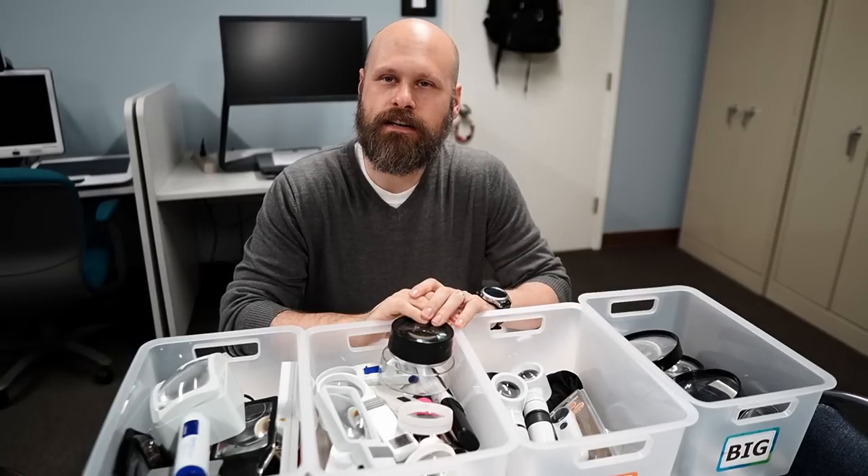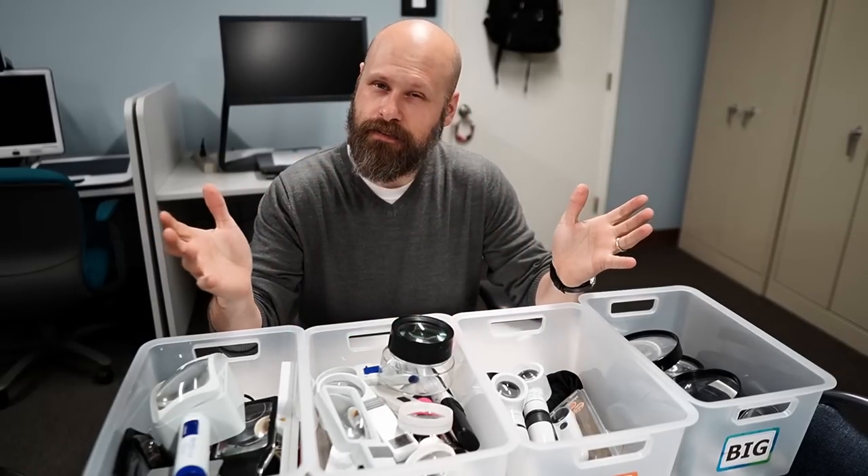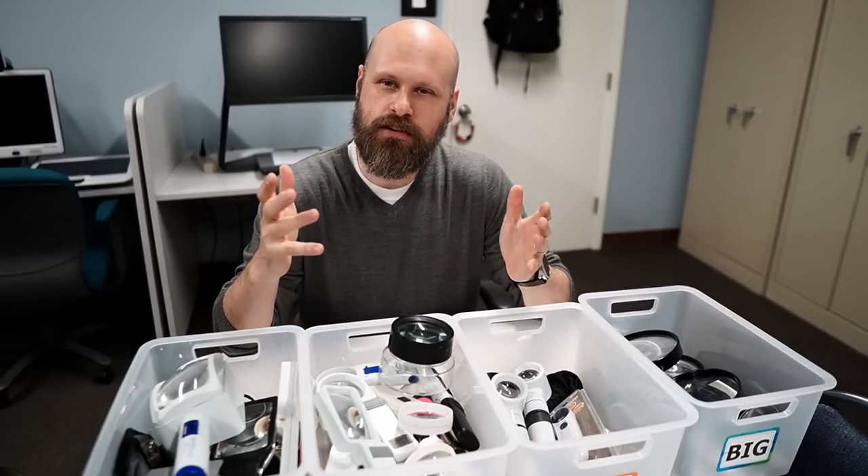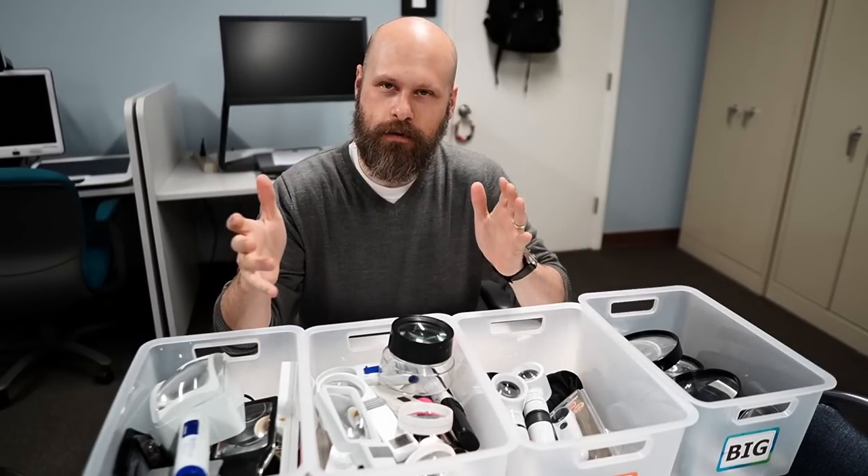Hey guys, it's Sam with The Blind Life. So today we're talking about magnifiers. I'm going to give you a little bit of information about them and tell you how to choose the right one for you.